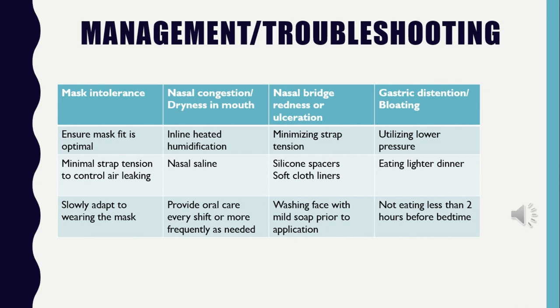Another adverse effect, of course, is nasal congestion and dryness in the mouth, and that's just because of all the positive air going into their mouth. Sometimes there's also humidification offered that respiratory therapy could provide. We could do saline to moisten their nasal passages. That would be through your physician order.